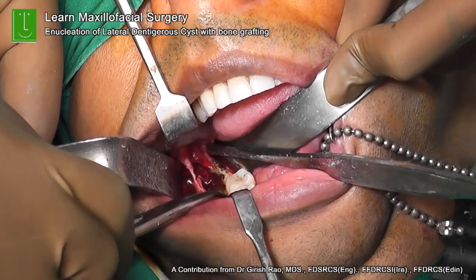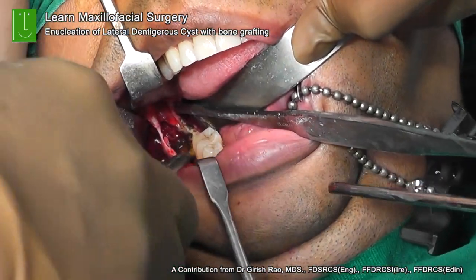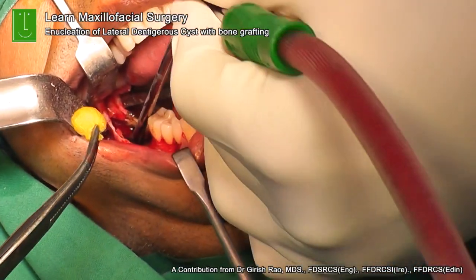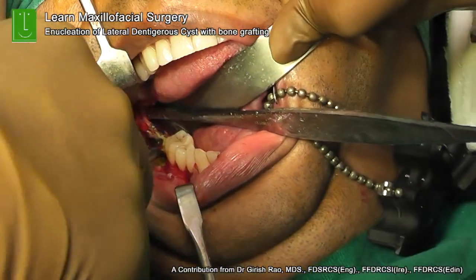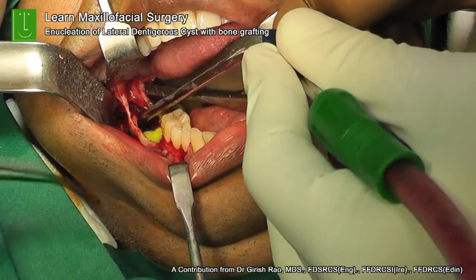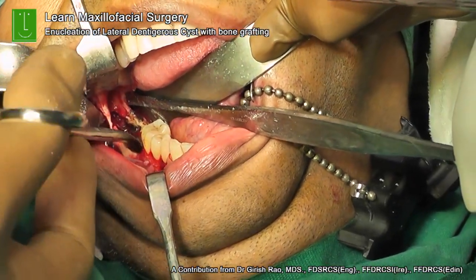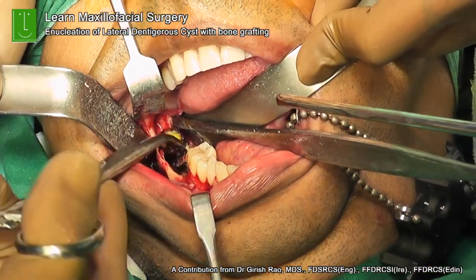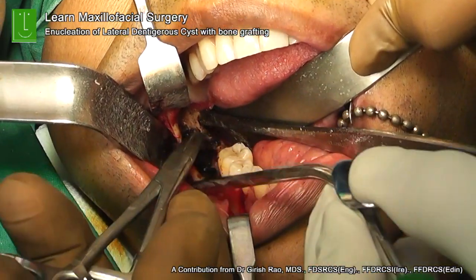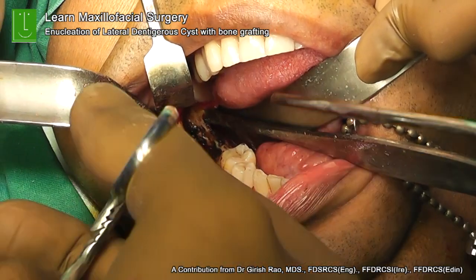And this Carnoy's solution is composed of a combination of 60% ethanol, 30% chloroform, 10% glacial acetic acid, and 1 gram of ferric chloride. It's a fixative agent, and it's mainly used in odontogenic keratocyst, where there is a higher chance of recurrence. But I tend to use it even in these kinds of large cysts. One of the advantages of this is even if there is a small daughter cyst, it's basically fixed.